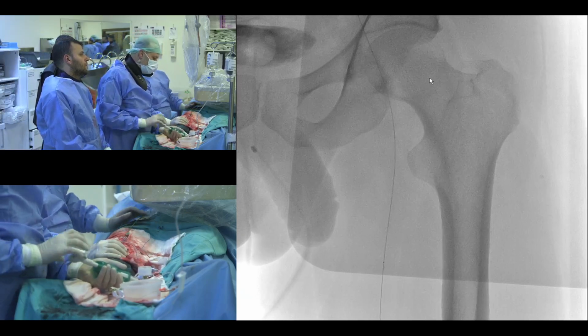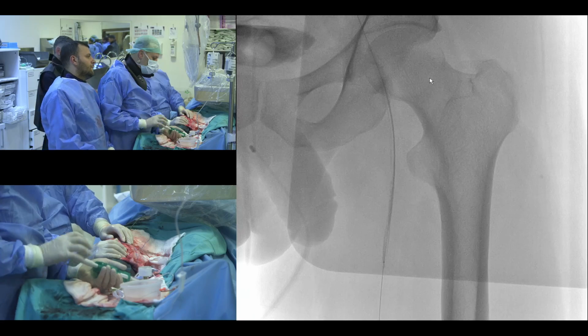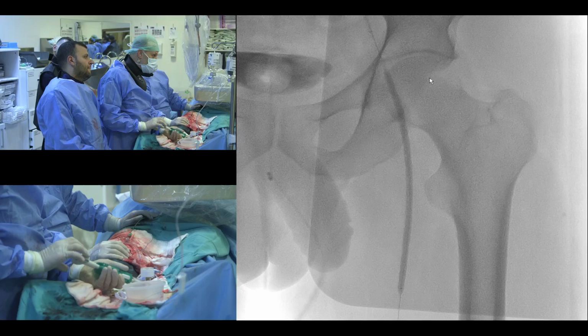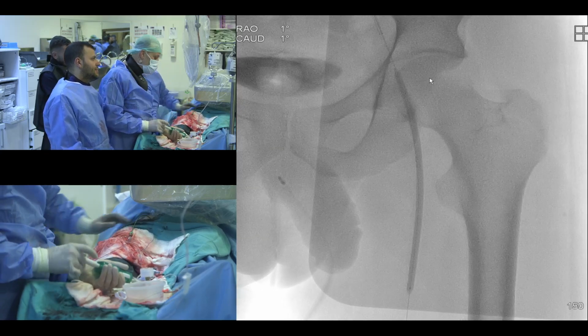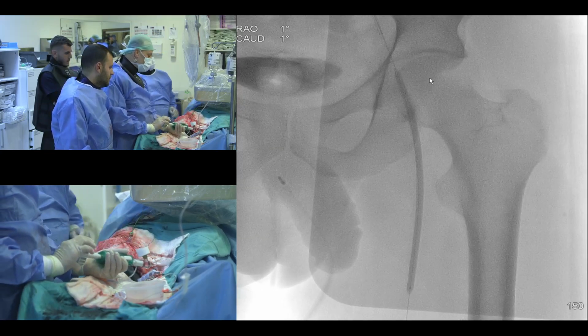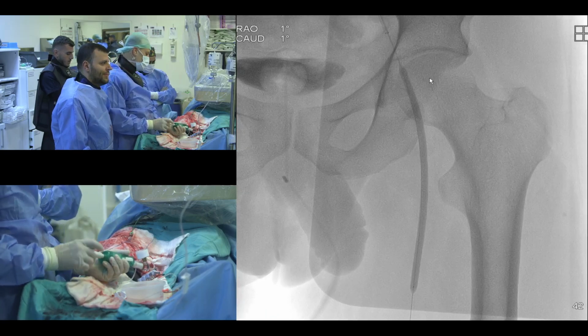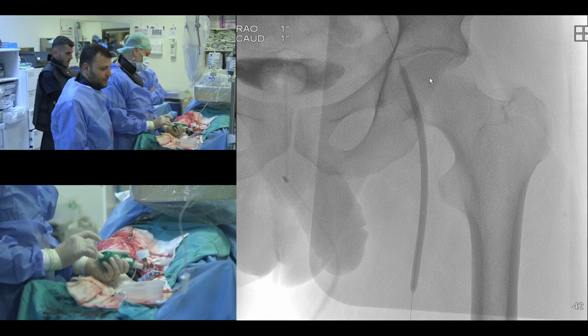We don't have any objection. Yes, Ahmet. So it's a very tough case. The distal landing zone is not clear, so we need marks for the distal part. I think the bidirectional approach will be more logical, especially in the first image.